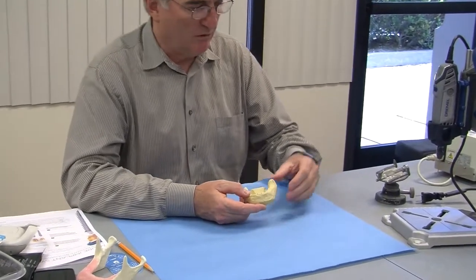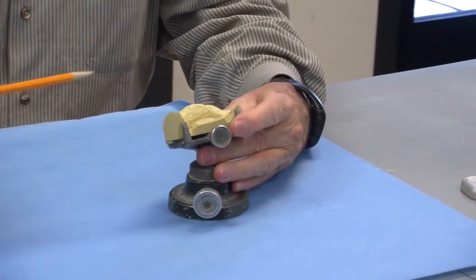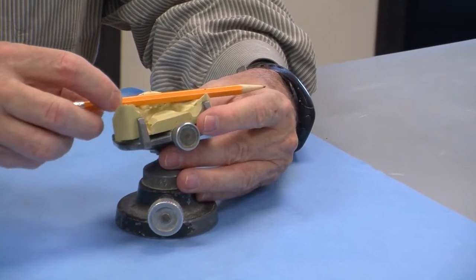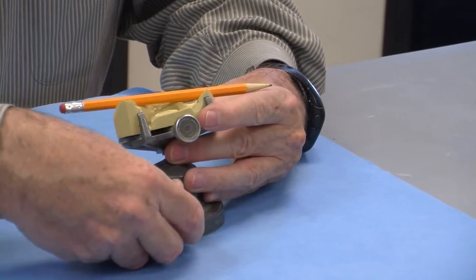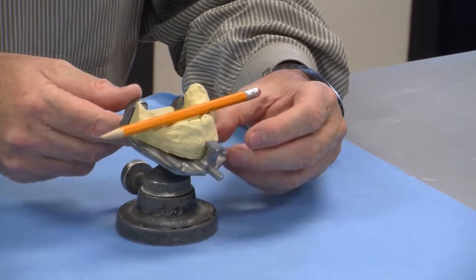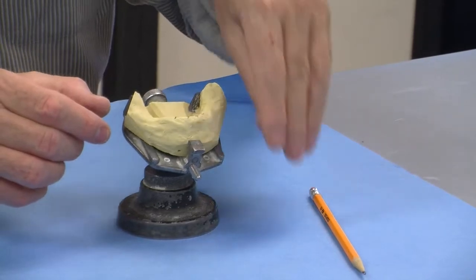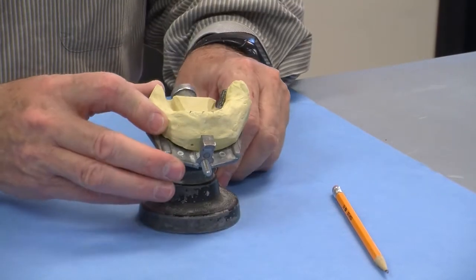We mount the model into a surveyor table. What we do is adjust the height into a horizontal position, and based on the orientation of the jaw, we tilt forward the surveyor table.